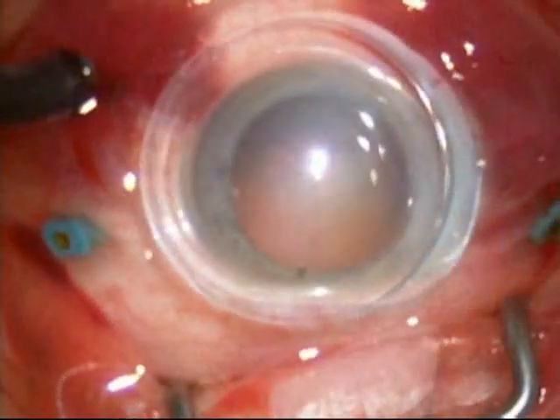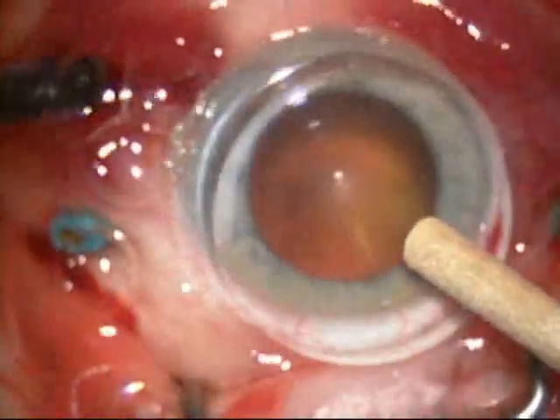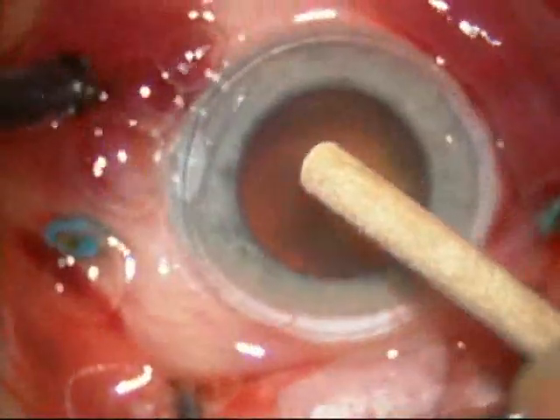Once the vitreous is removed, a high-resolution contact lens is placed on the eye. You're seeing that here.